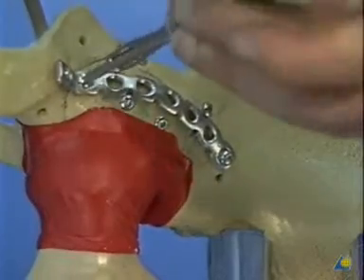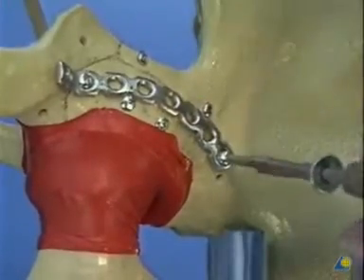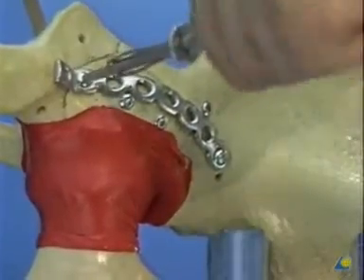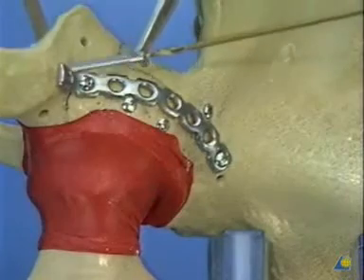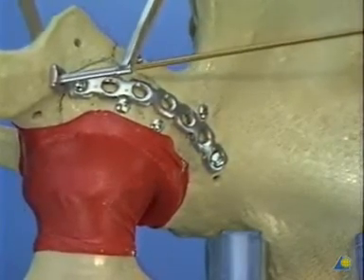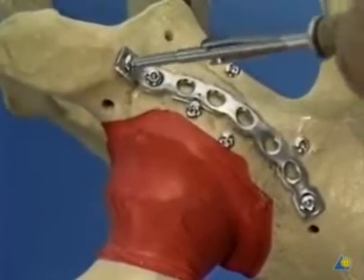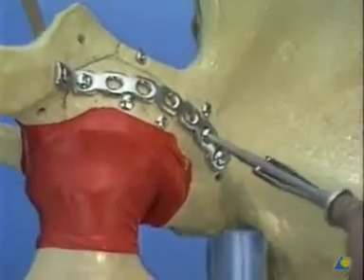Final tightening of these plate screws completes the final bending of the upper portion of the plate and ensures that the plate applies pressure to the posterior wall fragments and is tensioned over them. The distal screw is directed distally into the ischium. Another screw is placed proximally.